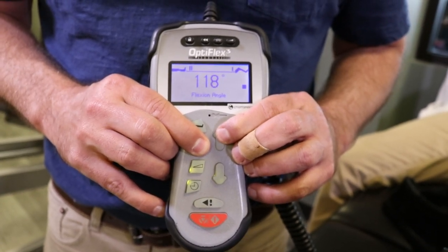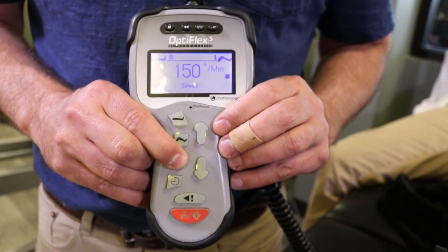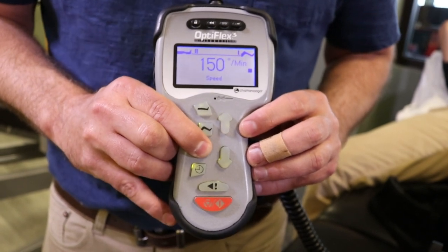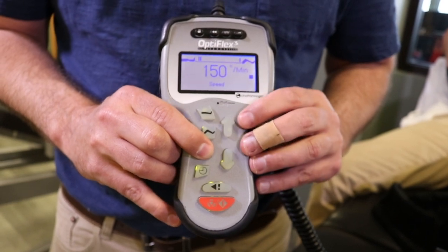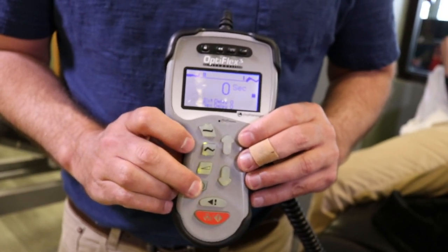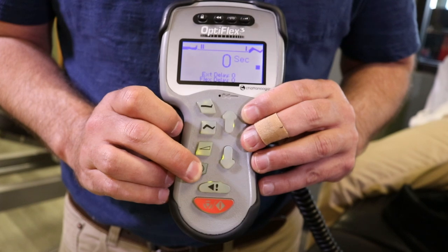The settings depend on the particular doctor's protocol. The button that looks like a little ramp is the speed — this machine goes as fast as 150 degrees a minute. It's completely up to the patient how fast they want to go. There's a school of thought that more cycles is better, so faster is better, but again that's up to the patient. There's also a pause delay timer — you can set a pause at the extension or flexion for however many seconds you want. That's mostly for ACL repairs and promotes an extra stretch at the top and bottom, which is beneficial to the patient.